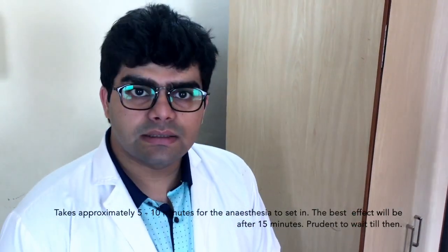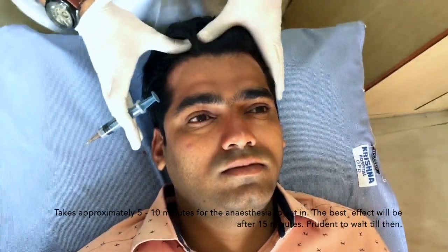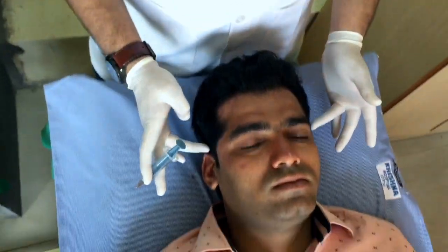Now we will test how the anesthesia is by asking the patient with pinpricks where he can feel it and where he can't. We have just one blind spot here, which the patient can feel but it doesn't pain — he can tolerate that much. Those blind spots are due to the zygomatico-temporal areas, which usually supply only the temporal triangles. It's not required to inject those areas since they are not typically affected by hair loss, so we avoid the zygomatico-temporal blocks. With just four injections, the patient is totally comfortable up to the vertex.